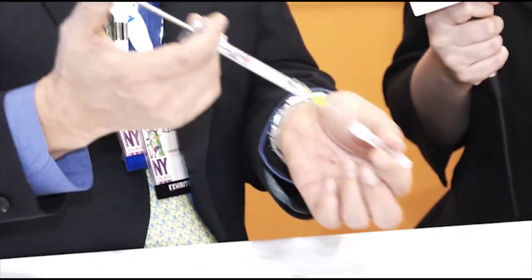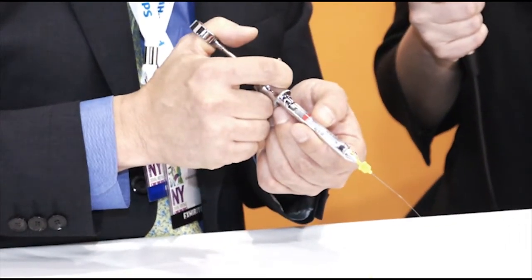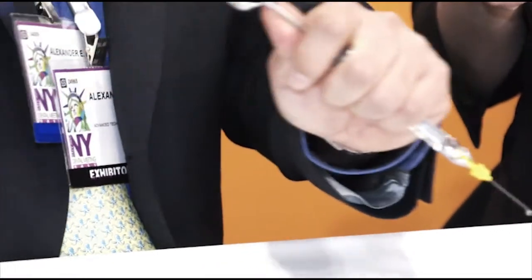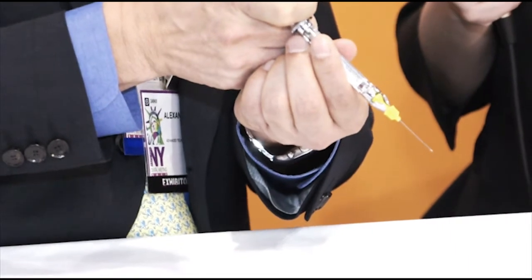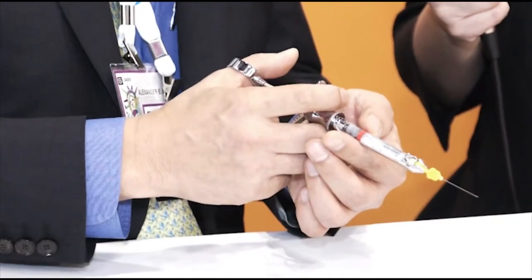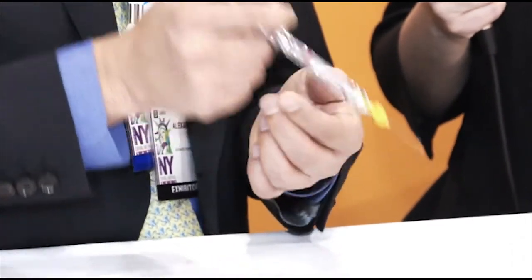Prior to use, you remove the cap, and as you inject, you see that the cartridge is being pushed forward, which is the self-aspiration feature. Previously, the doctor had to tap it and aspirate fully to see whether blood is returning. But with this needle, you don't have to aspirate actively — you only have to stop pressing it, and it will aspirate for you.